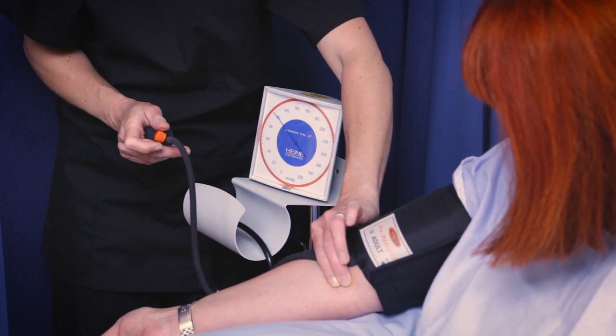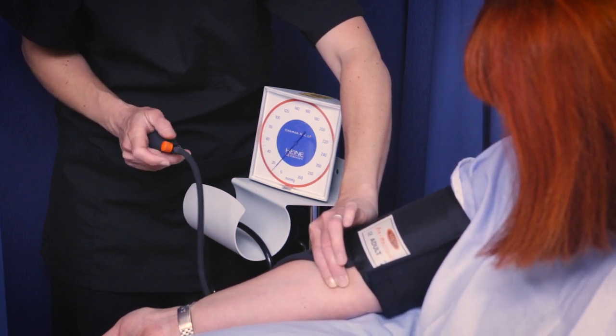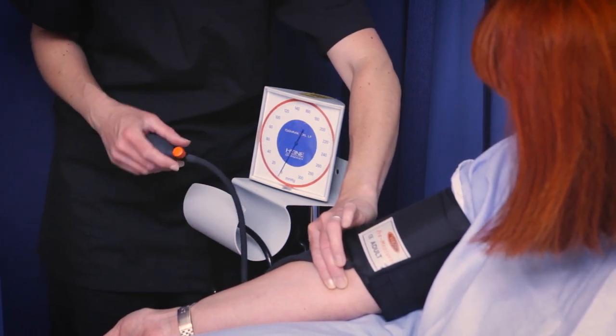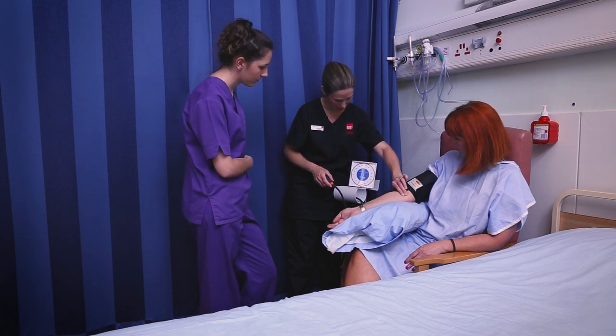Then I'm going to let the cuff all the way down. So that's now my estimated systolic reading. Because if you remember, blood pressure has two measurements — the systolic and the diastolic. So that's the estimated systolic reading.